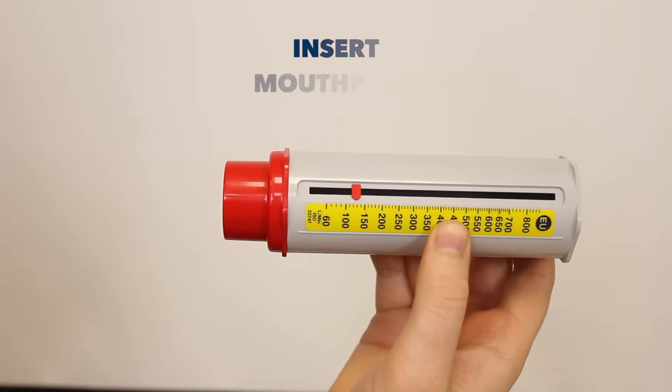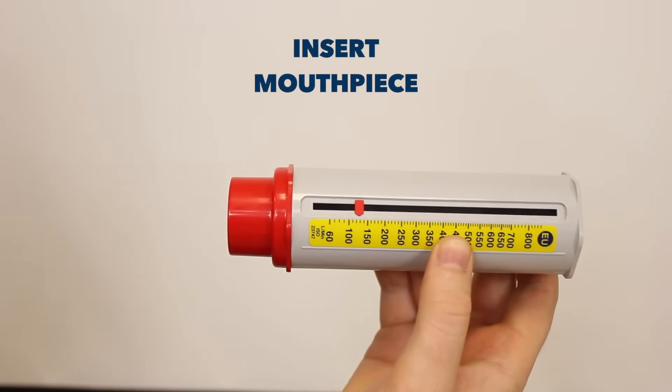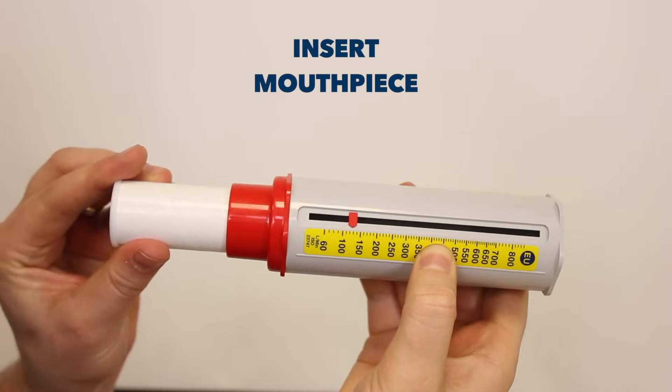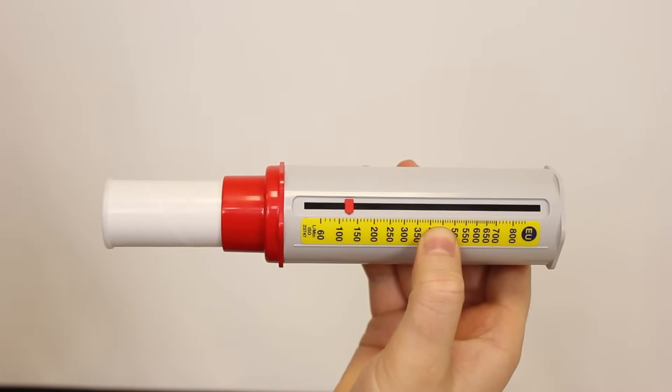Okay Simon, in terms of setting up the equipment, the important aspects are to ensure that the mouthpiece is inserted into the peak flow meter, and to ensure that the dial is set to zero.